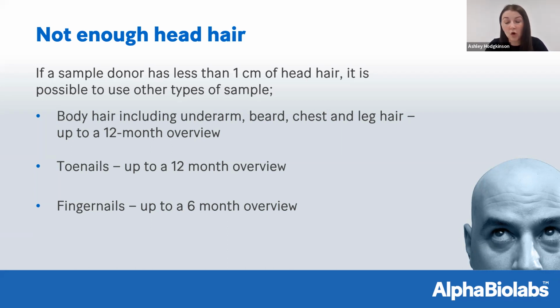We can also do back, forearm, whatever your client is comfortable to provide. However, it's important to note that if you do test a sample of body hair, it will cover 12 months and that will be as an overview. So it cannot be segmented.